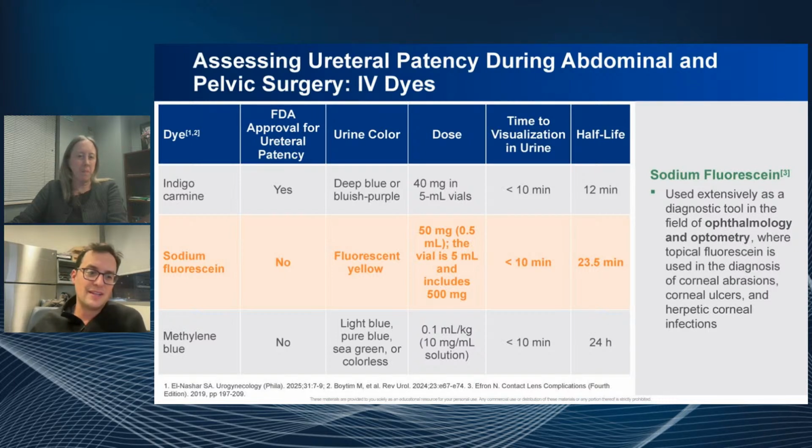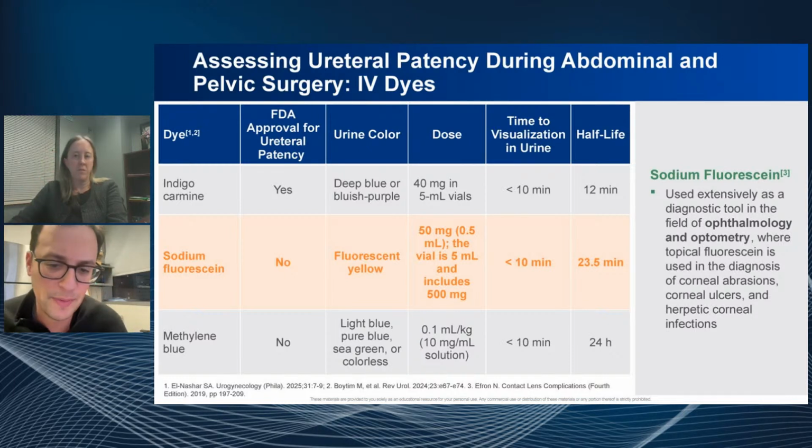I do notice, and we'll talk about this in the cases that I'll ask you about later, it's such a good agent at dyeing the bladder that I've been fooled by sodium fluorescein into thinking that it was blood coming out of a ureteral orifice, because the whole background is orange and then there's a darker orange that comes out. So it's great to see the initial flush. But if, let's say, the nurse doesn't have the water set up appropriately, or maybe the cystoscope tray is contaminated, I do worry about the ability to see and to look for other things.